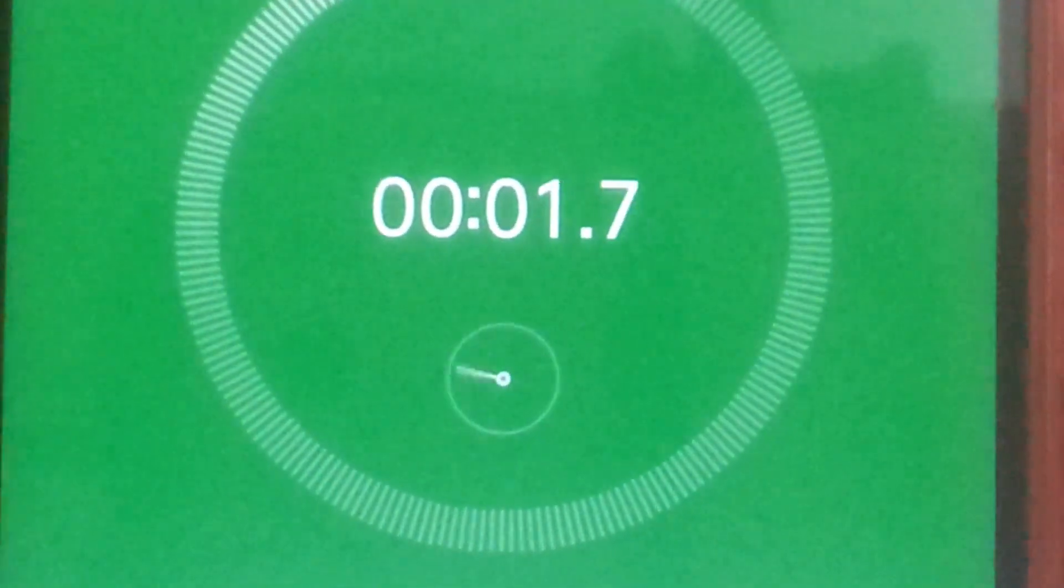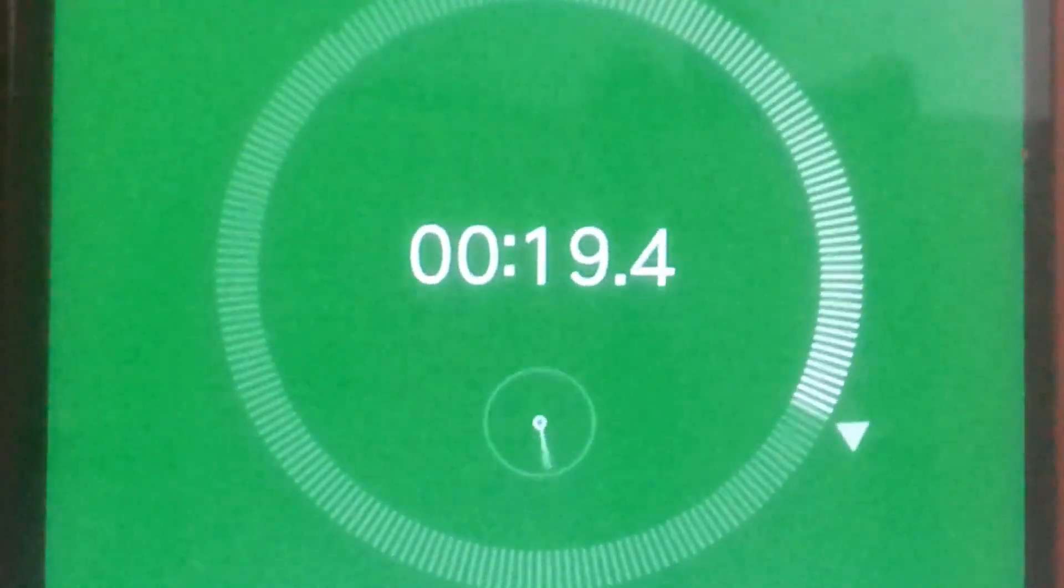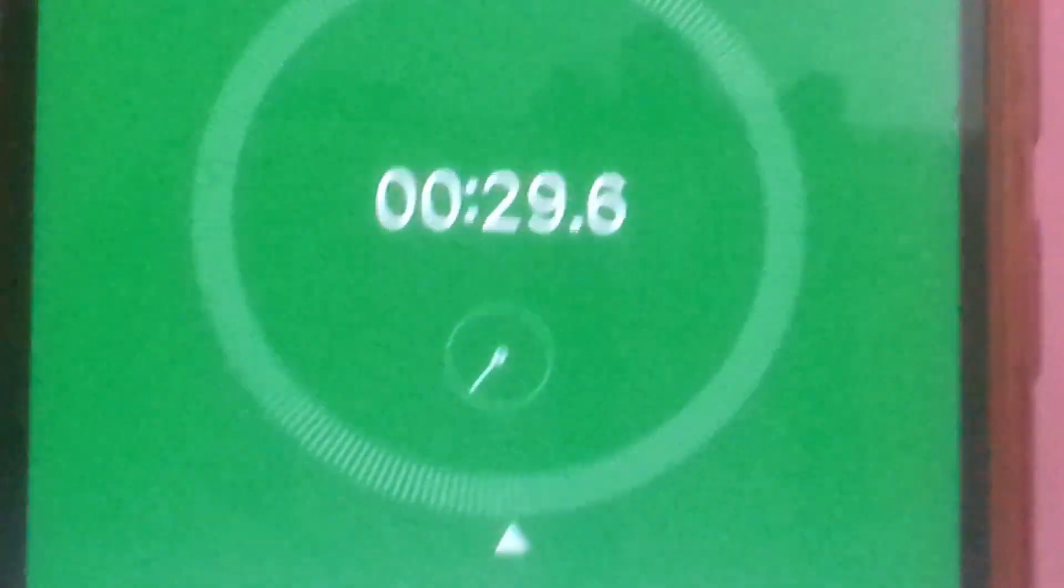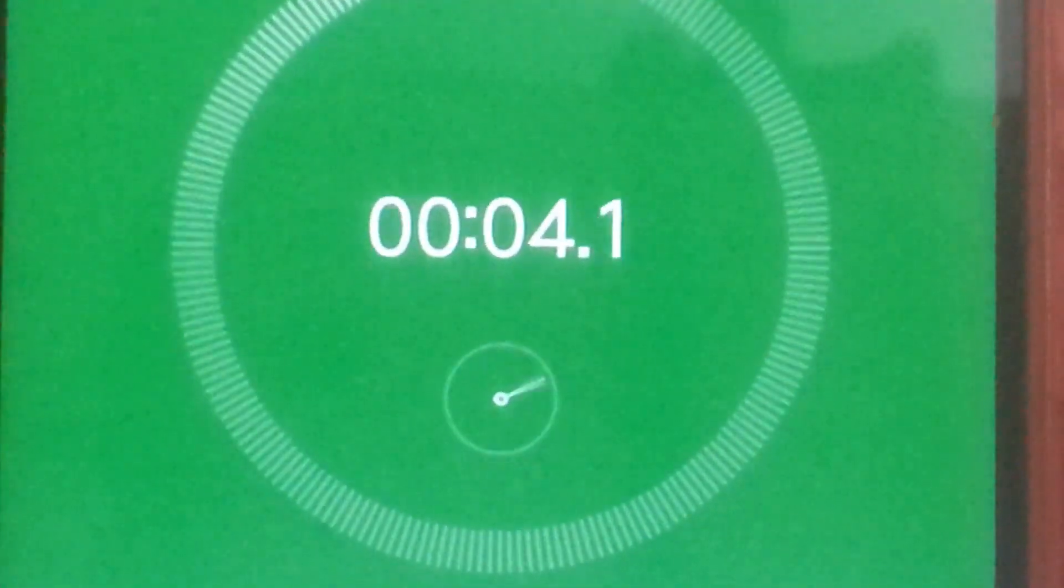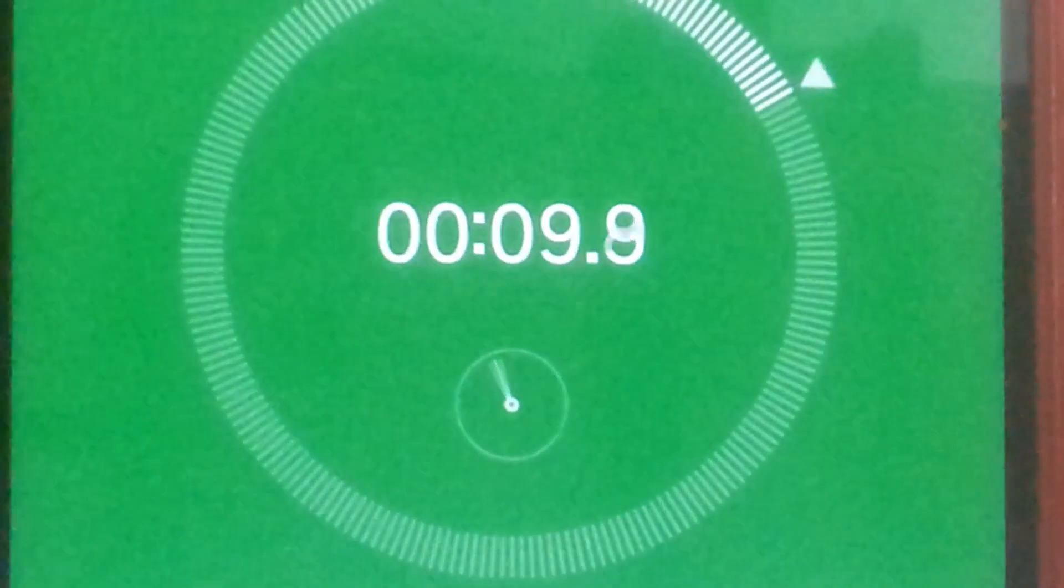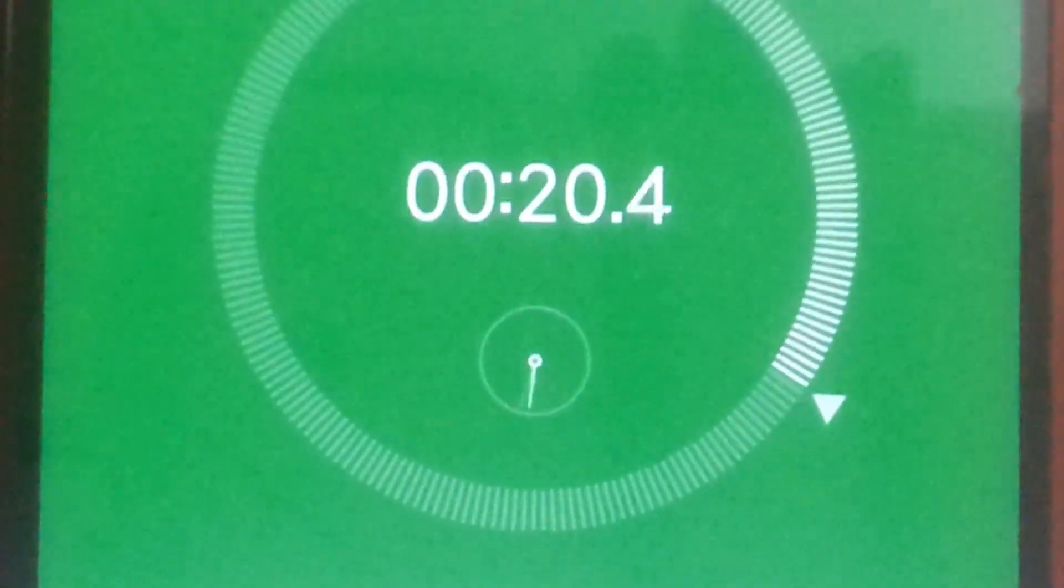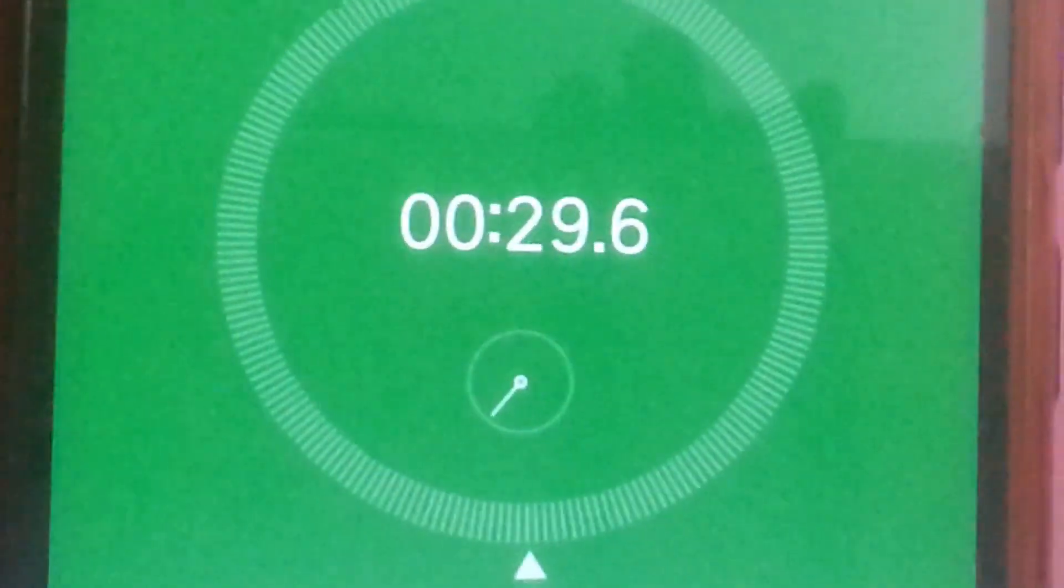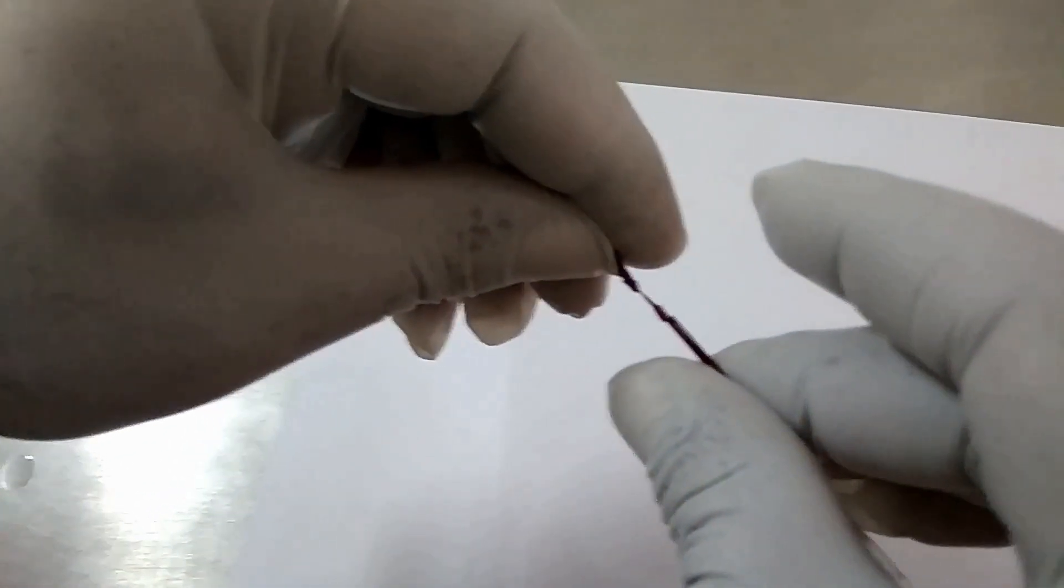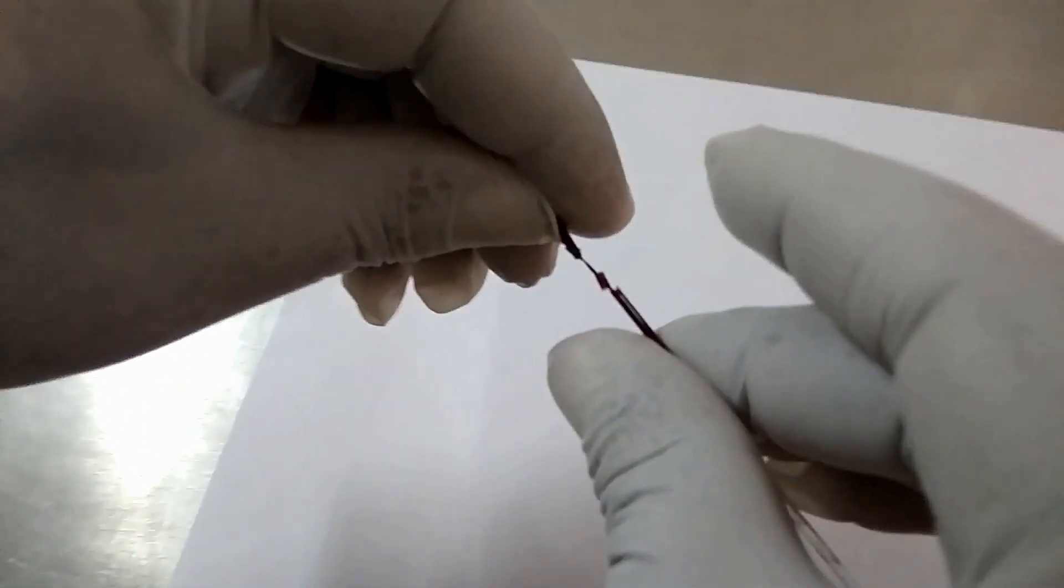6 previous attempts and final one is equal to 7. 7 times 30 seconds is equal to 210 seconds, that is 3.5 minutes, which is the blood clotting time.